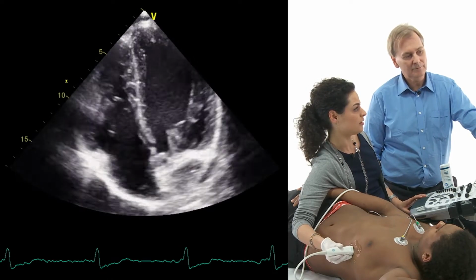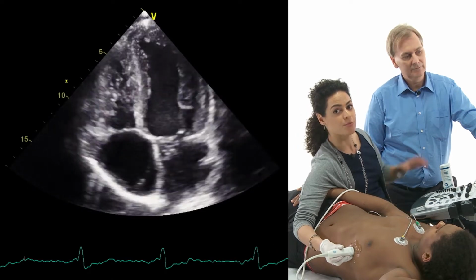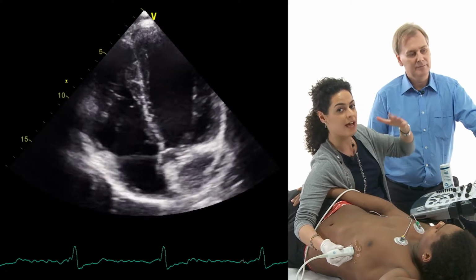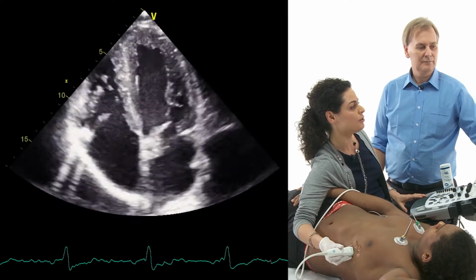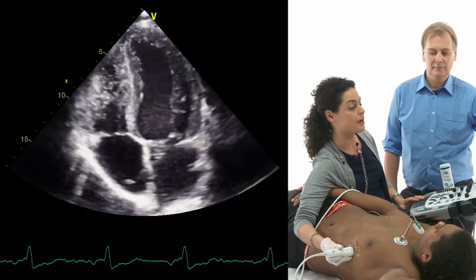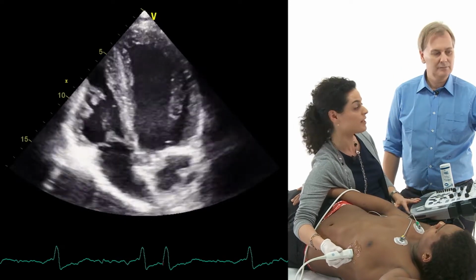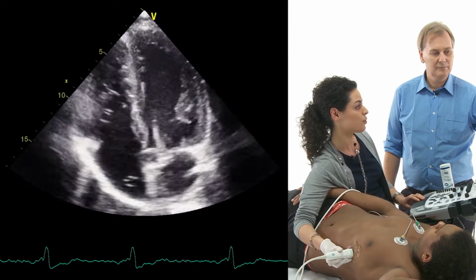So actually, the right ventricle, in comparison to the left ventricle, moves more using the longitudinal contraction, where the left ventricle uses more the radial contraction. So we really should look at the movement in systole and diastole of the tricuspid annulus. We can do it visually. When you really have big excursion of the annulus, we can say the function is more likely good.